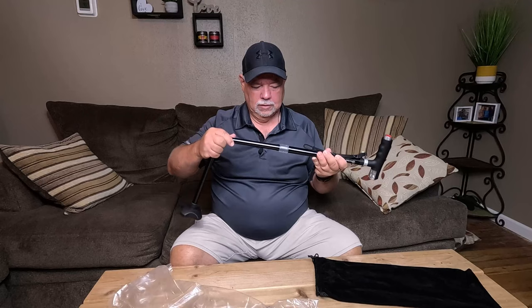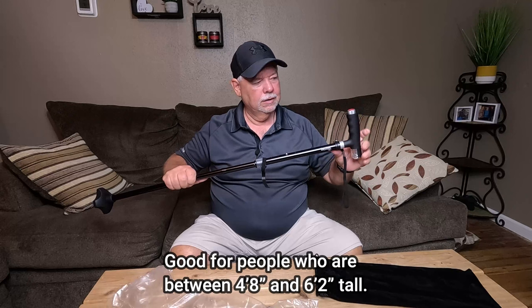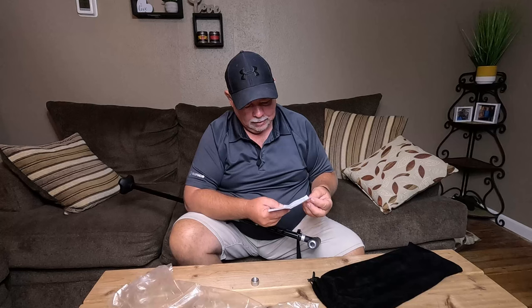Tighten that up. This is adjustable — it has these little push pins so you can adjust the length to whatever length you need. Looks like it may take some batteries. Yes, looks like it's going to take a couple of double A's. There are some instructions in here, but it's pretty self-explanatory. There's a down light right here and then your headlight right there.